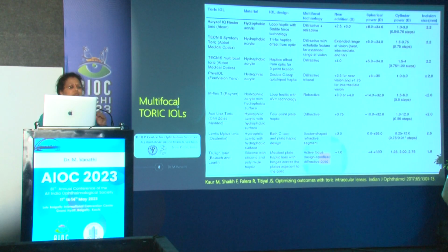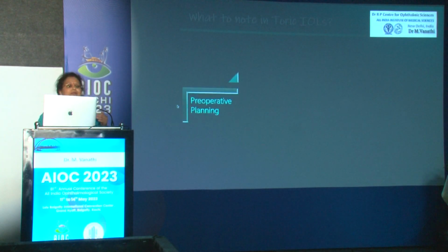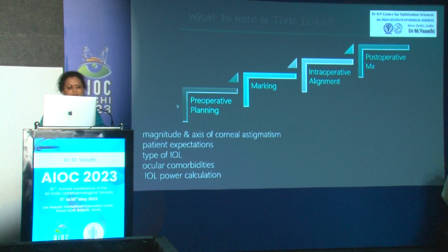But when you're moving to presbyopic toric IOLs, the quantum which you're going to use is much lesser. So if you're looking at astigmatism more than 0.7, 0.8 on the ocular surface here, the corneal toricity, then you're probably going to look at a toric in terms of trifocal IOL. So that's how shifting from monofocal torics to trifocal torics is going to work when you're planning toric IOLs here.